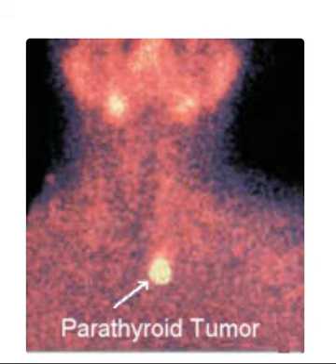Typically, a doctor will take multiple Sestamibi scans of a patient's parathyroid glands. The initial Sestamibi scan of the parathyroid glands is performed within about 10 minutes of injection of the radioactive agent. It's very important that the first scan is done within 10 minutes, otherwise it will not be as accurate. A second Sestamibi scan is also completed approximately 90 minutes after this injection. Meanwhile, the first Sestamibi scan usually requires about 20 minutes to complete, and a patient can often go home about 45 minutes after the second scan.